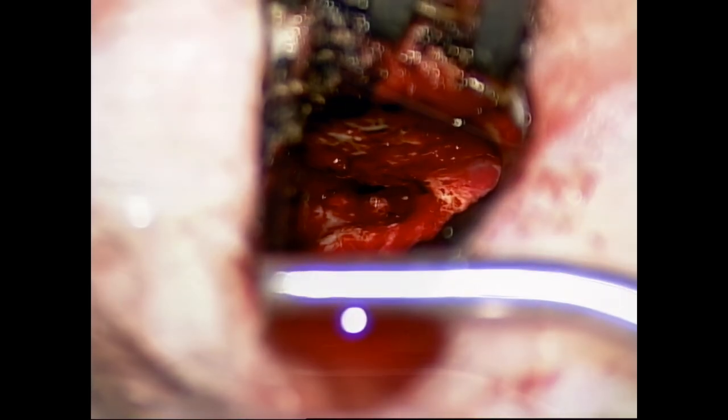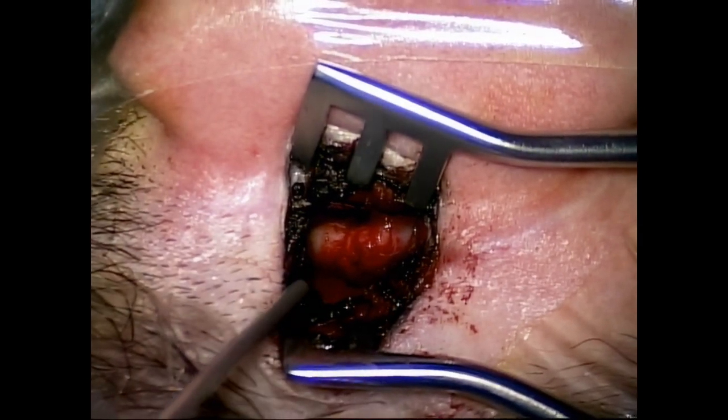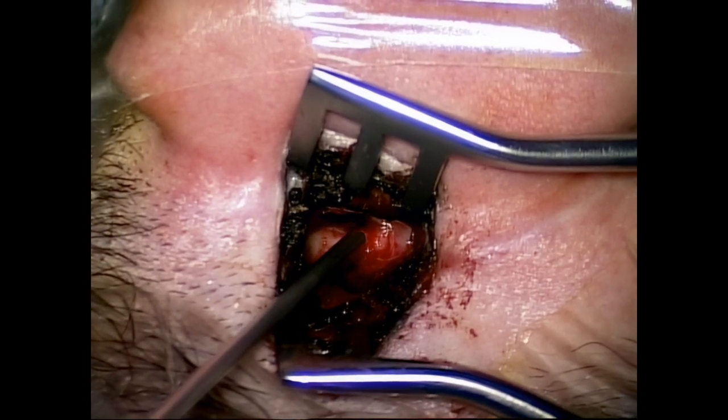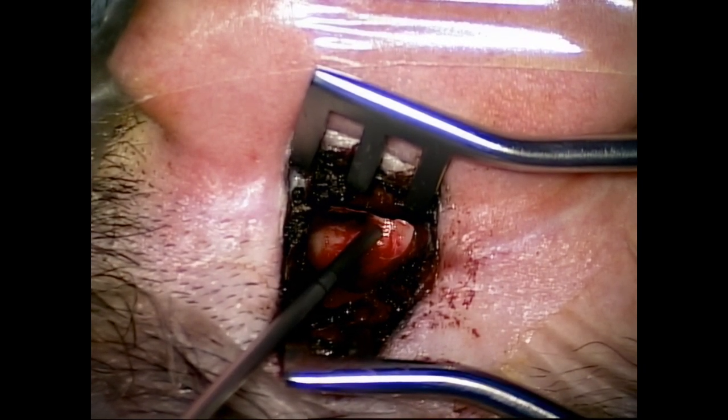Now the endoscope is useful in these situations because you want to look beyond just what is visible through the posterior tympanotomy with the microscope to rule out any recurrence. Now I'm going to show you the reconstruction, but first let's take a look. So now we're taking a look. There is the eustachian tube orifice.